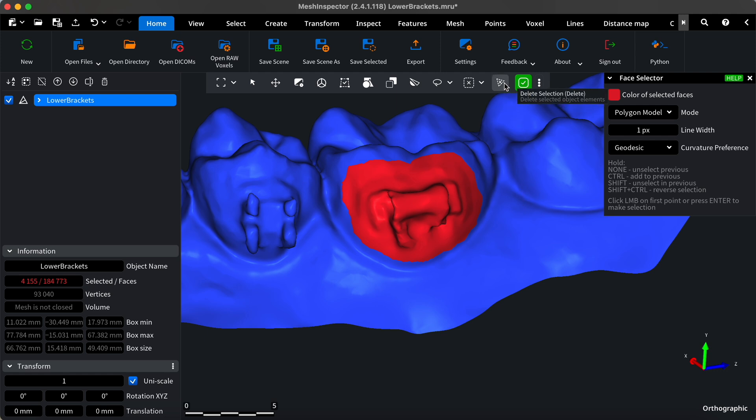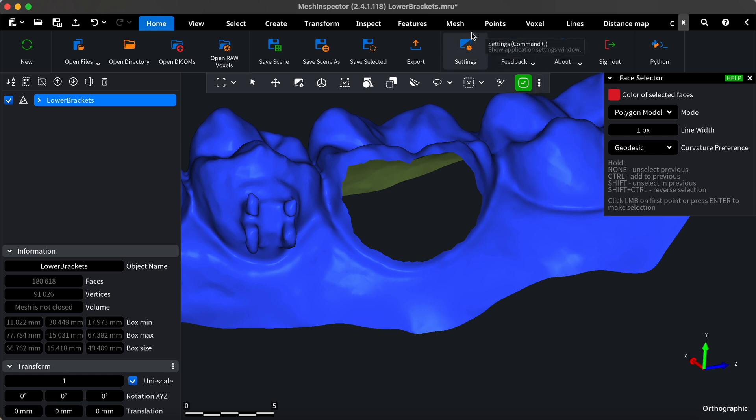With the desired area selected, press delete selection or use the delete button shortcut to remove the brackets.